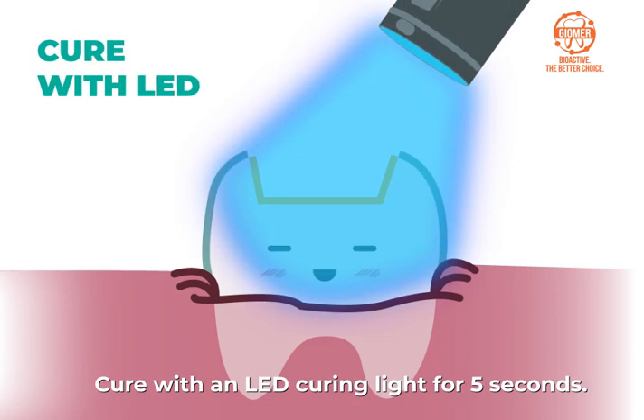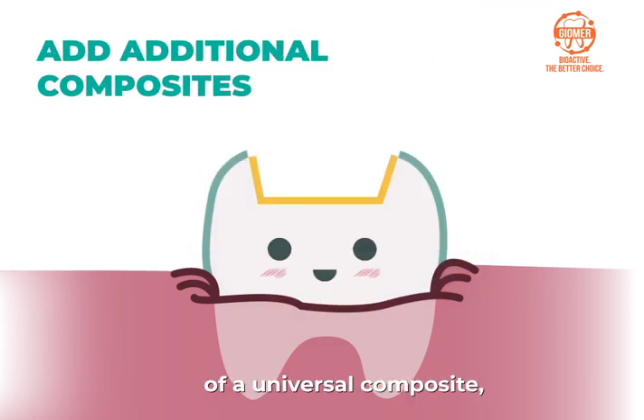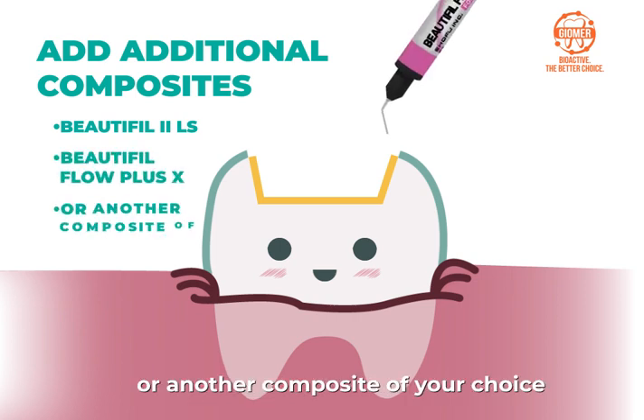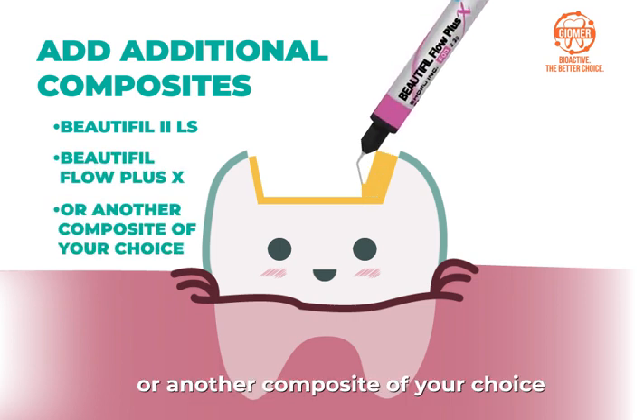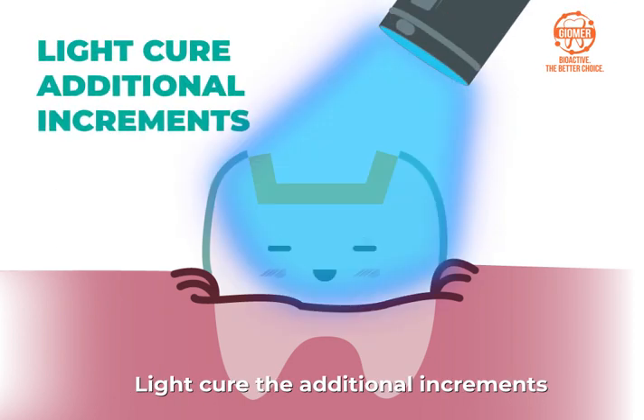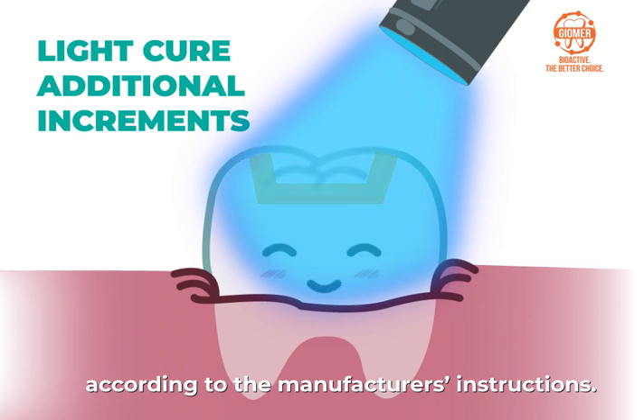Cure with an LED curing light for 5 seconds. Add additional increments of a universal composite, such as Beautifil 2LS, Beautifil Flow Plus X, or another composite of your choice, according to manufacturer's instructions. Light cure the additional increments according to the manufacturer's instructions.